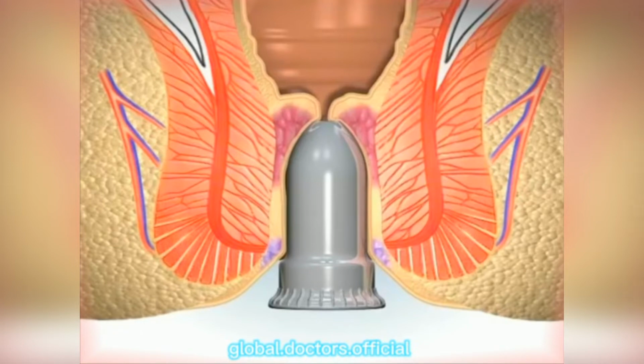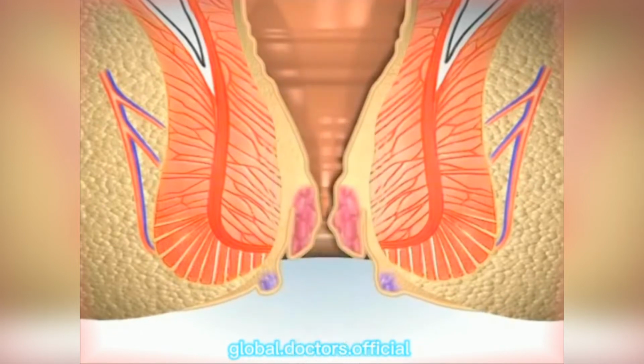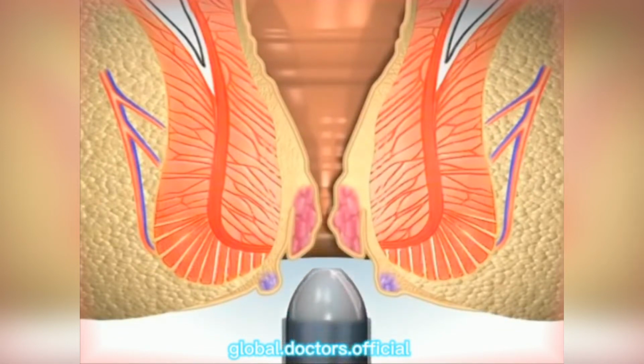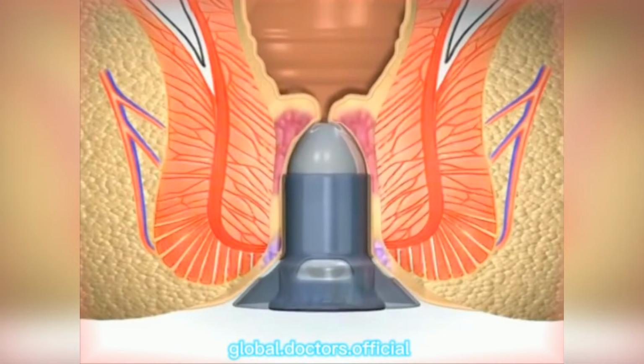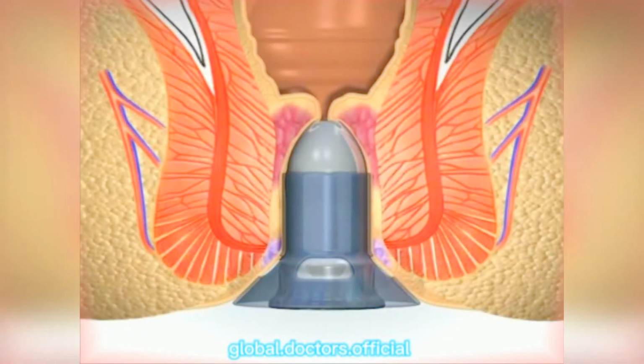It is recommended that the obturator be inserted alone as part of the dilation process. This will help to prevent damage to the internal sphincter. The obturator is then removed, and the circular anal dilator with the obturator in place is inserted. This pushes back the mucosal prolapse into the anal canal.